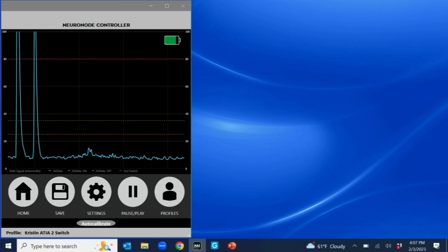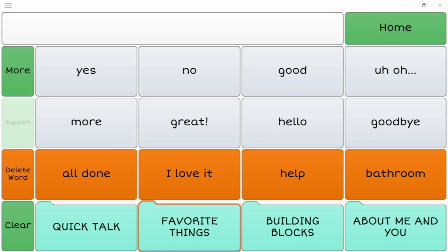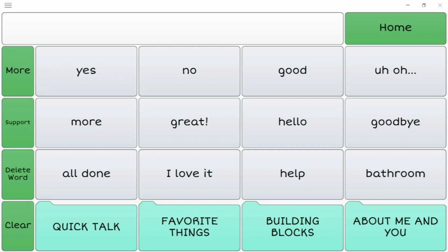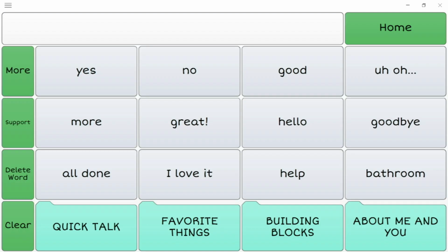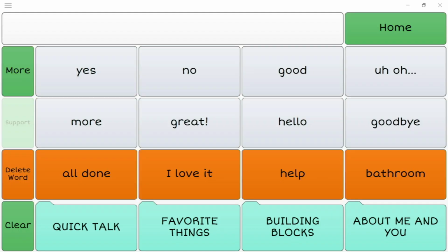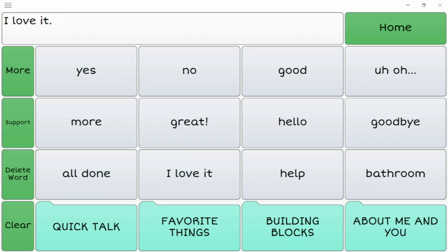So if I go into my grid software, I have my small movement set to move the cursor, and then I have the bigger movement set to activate it. So I'm going to do a small movement to move. I'm going to pick "I love it." So I have to do a big movement here to pick that row. And then I can do, that was too big of a movement. So I'm going to do my small movements. To get here, now a big movement. Small movement. Big movement to select "I love it."